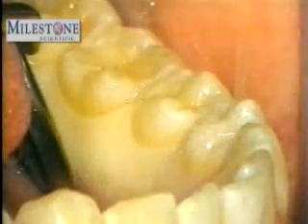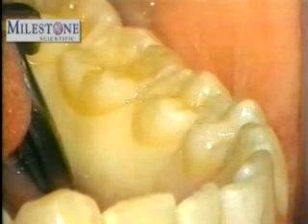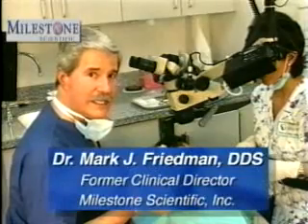Now that the PDL injection has been given properly, look for clinical signs and symptoms of anesthesia. The only clinical sign of anesthesia will be blanching or ischemia of the soft tissue surrounding the tooth. The only clinical symptom of anesthesia will be the patient telling you that the soft tissue or the tooth feels numb. With the aid of a microscope and intraoral camera, we'll demonstrate the PDL technique clinically.